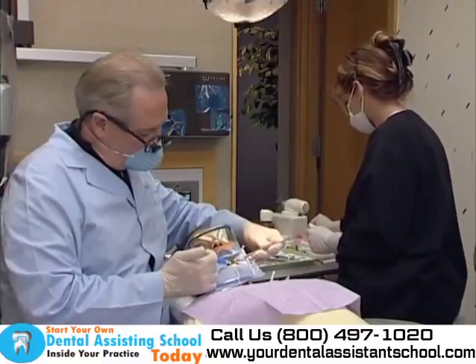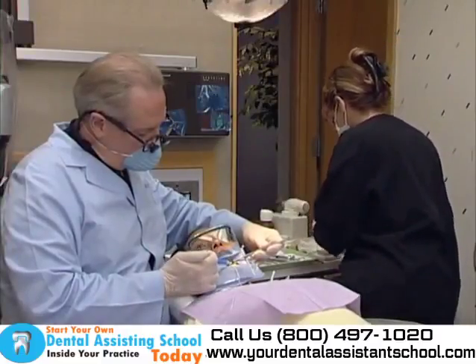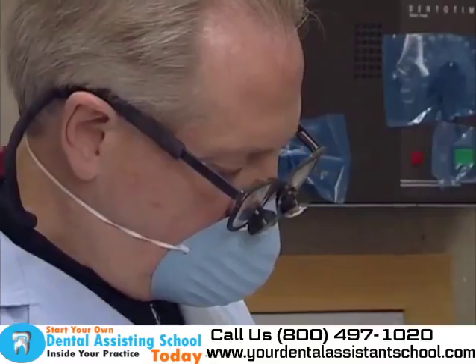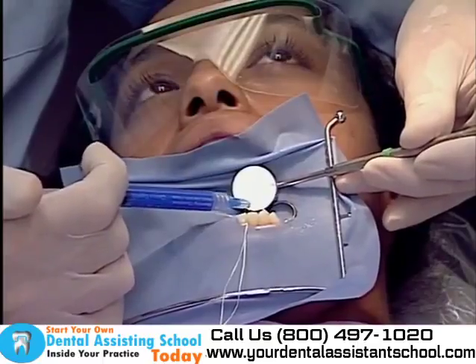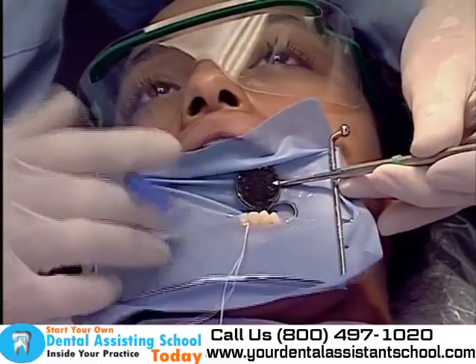Depending on the type of procedure that is to be done, the dentist may request that a rubber dam is used. A rubber dam isolates specific teeth to be treated. The field of vision for the dentist is increased when using a rubber dam, since saliva, blood, the tongue, and lips are not able to intrude upon the isolated area.